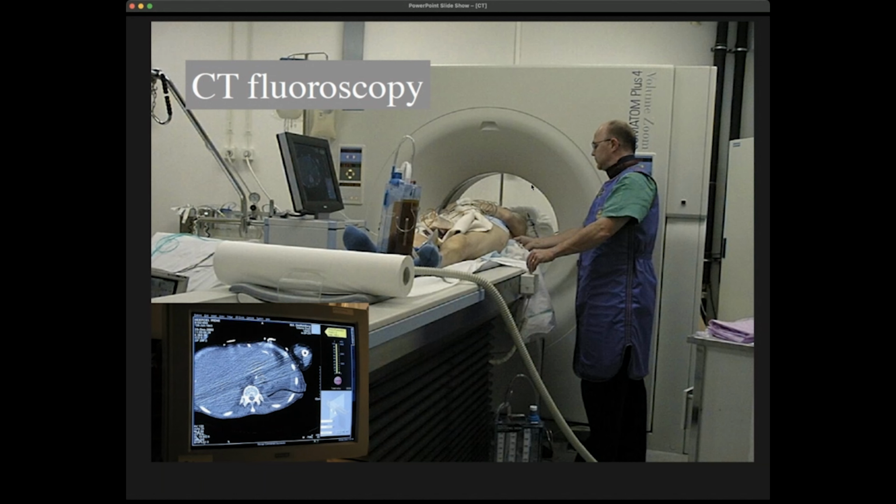And so here would be a typical CT scanner. What you see here is the tube or the opening of the scanner. In between, you have the rotating X-ray tube and detector that rotates fast around the patient. The patient is on the table, and can go through here.